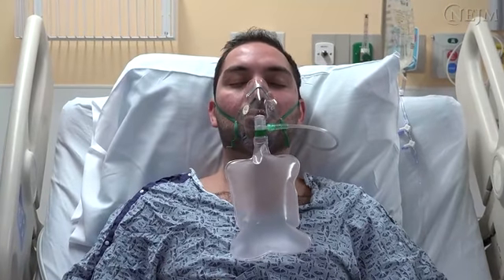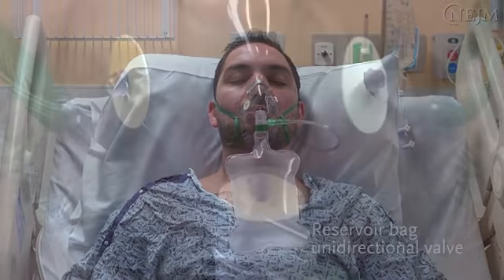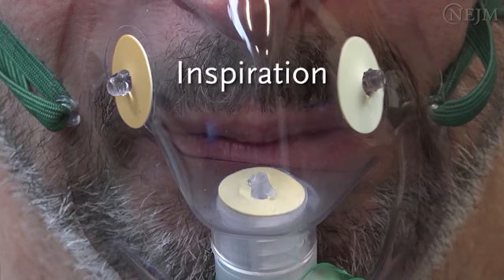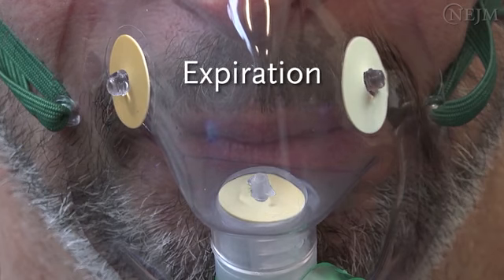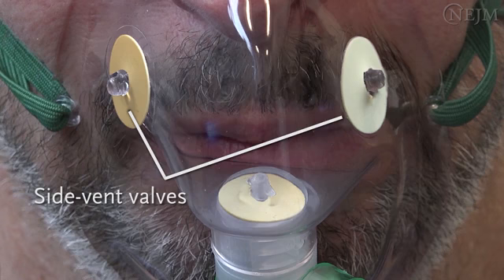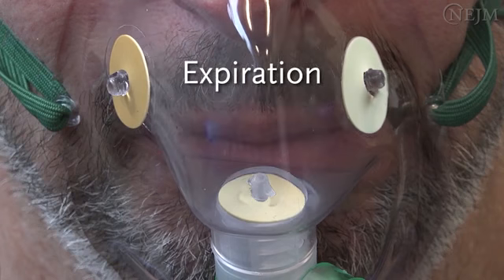A non-rebreather face mask is a face mask that has been modified to include an oxygen reservoir bag. A unidirectional valve allows flow of oxygen from the reservoir during inspiration, but closes the reservoir during expiration, allowing the reservoir to fill with 100% oxygen from the fresh gas source. Non-rebreather face masks may be equipped with 1 or 2 side vent valves that close during inspiration to prevent entrainment of ambient air and open during expiration to minimize rebreathing of exhaled gas and reduce the risk of hypercarbia.